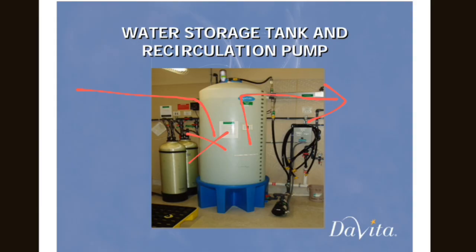It is recommended that the corner be oval shaped, not L shaped, because an L shape can grow bacteria, and there is no dead end of a pipeline. So it is basically a recirculation process where water from the storage tank recirculates and drains again into our tank.